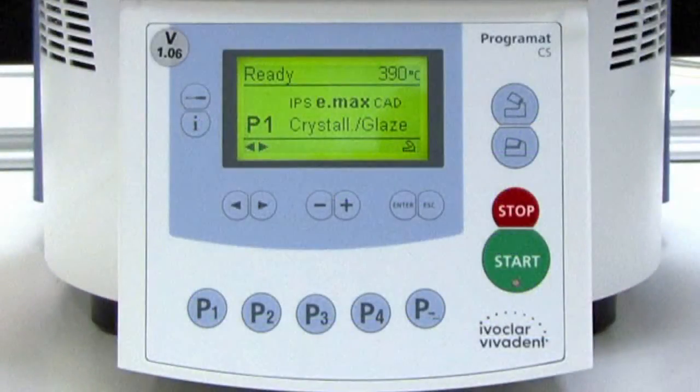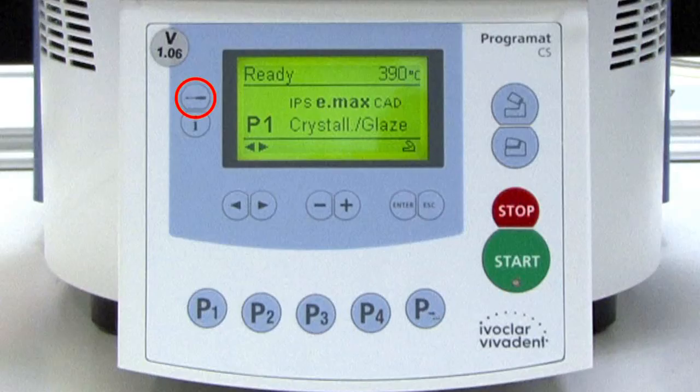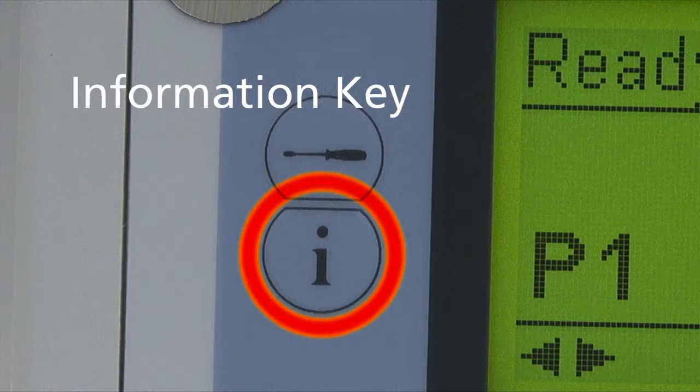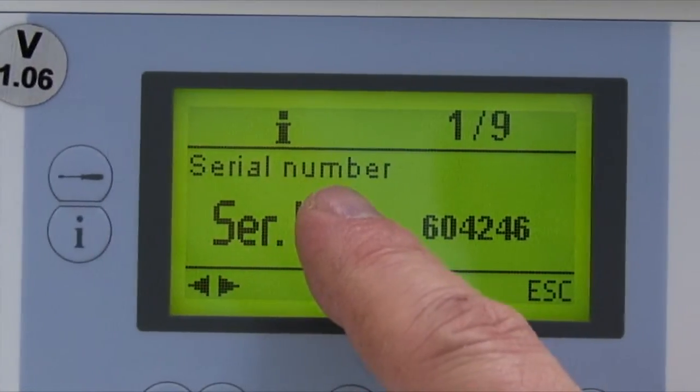Let's take a moment now and go over the function keys. The settings key, or screwdriver key, once pressed, displays the settings of the CS and allows changes to be made. The information key is used to display information such as the CS's serial number.